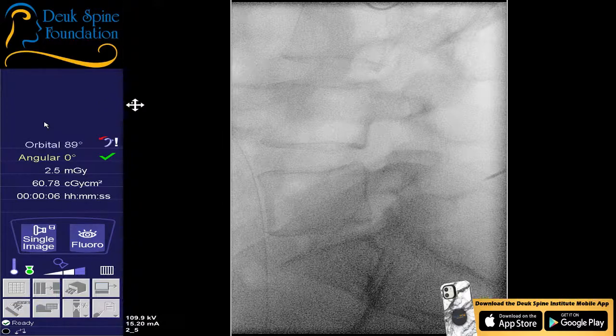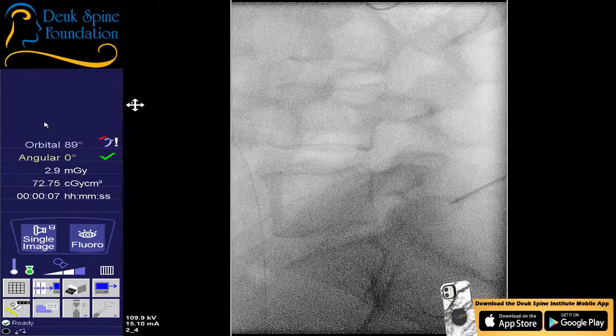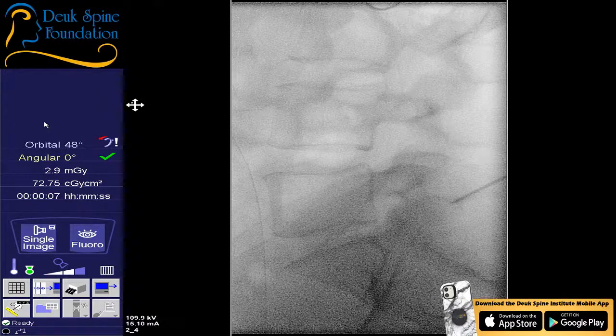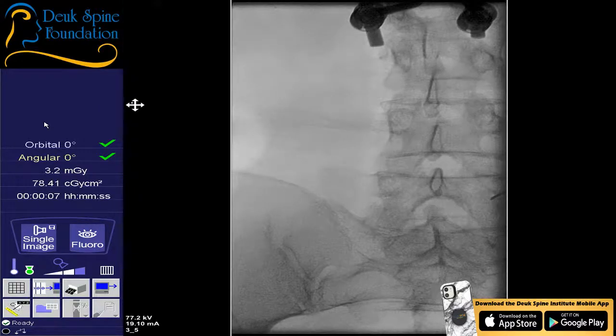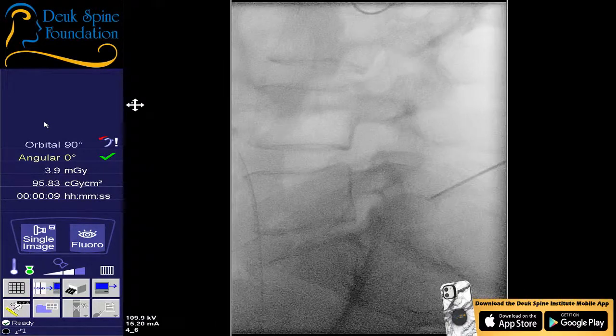Shot. Let's get an AP. It doesn't feel like the facet. Just a quick AP. Yeah, too medial. All right, back to a lateral view.